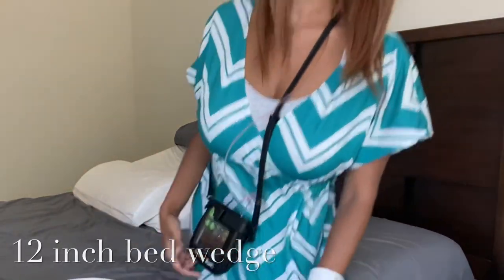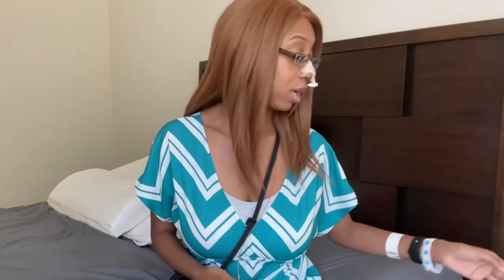That has worked wonders. You keep this tube in for a day, and you go back 24 hours later. They will accept it within 22 hours, so you can go back as early as 22 hours, but they do want at least 24 hours of recording. You can still drink water, you just may have to go around the tube a bit.